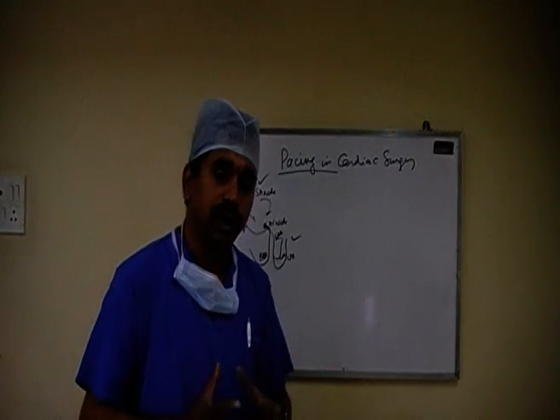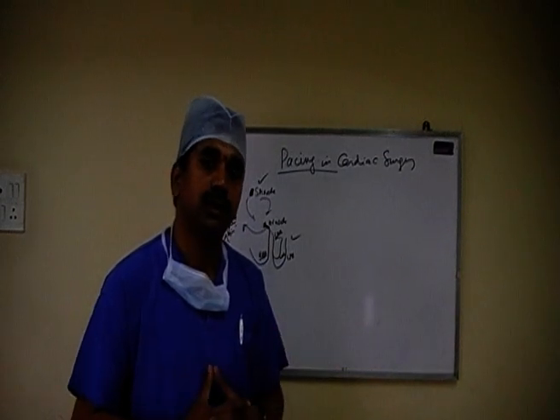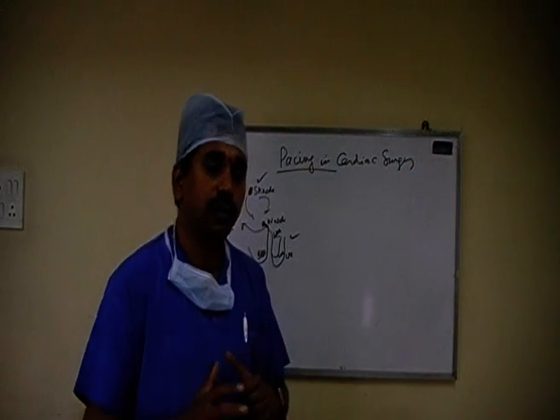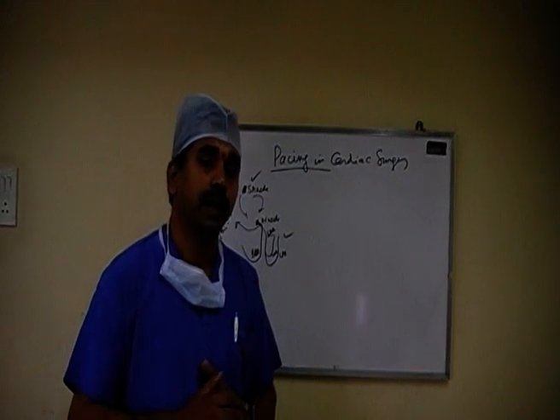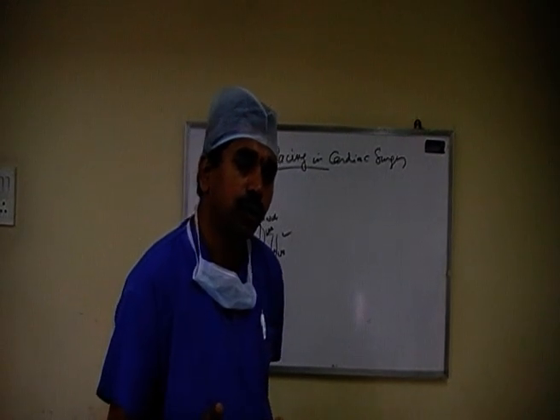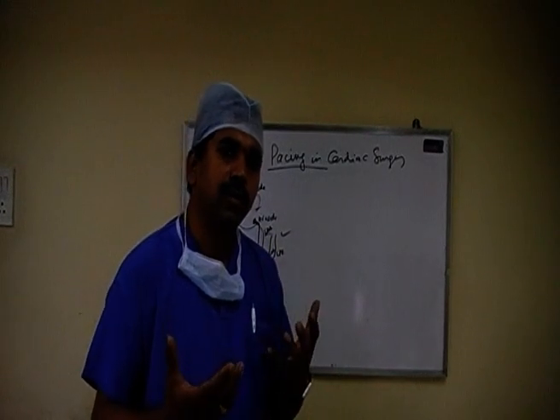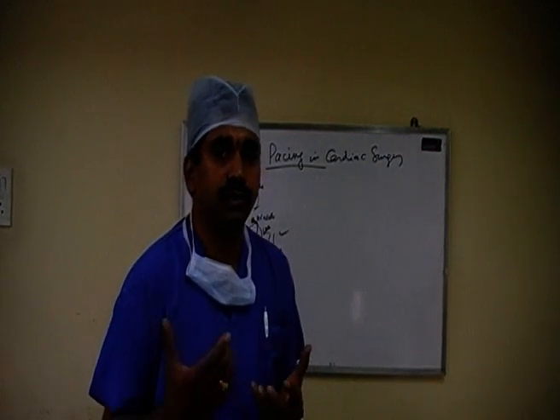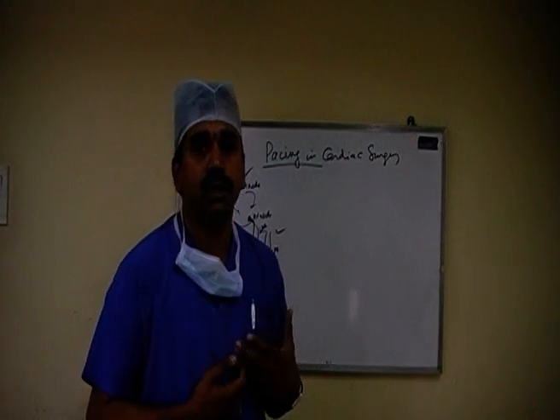So again, I will recommend you to go through the reading of pacing, familiarize yourself. Cardiac surgery is one faculty where you can really save lives if you know how to deal with the pacing and pacing box in the post-operative period. Once the patients are out of danger, usually it will be 3rd or 4th post-operative day, and usually 5th post-operative day, by which time all the myocardial edema and everything would have settled, and so any pacing related problems are very unlikely to happen after 5 days. And hence, usually on the 4th post-operative day, we tend to take the pacing wires out.